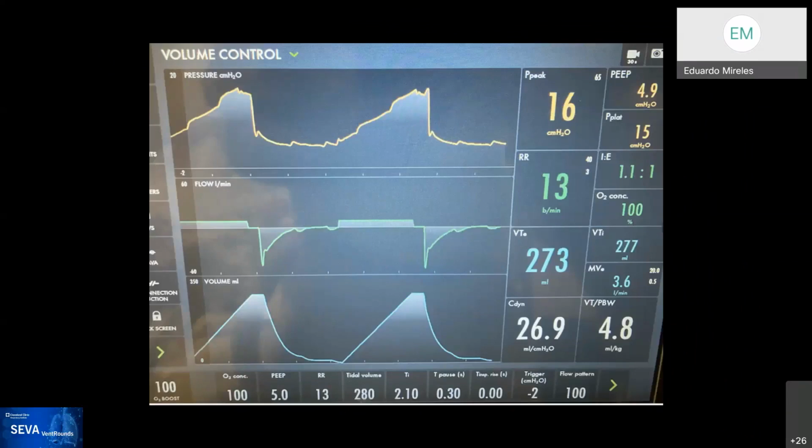So then I change it even further. Why not? To hell with it, right? So let's improve this a little bit more. Now we drop the rate, with the same total volume, but I gave him enough inspiratory time to be able to see if this was actually the stress index. What was happening here? It was so distressing. And so again, it's volume control. We agree on that. But now you have a little bit better view into those aberrancies.